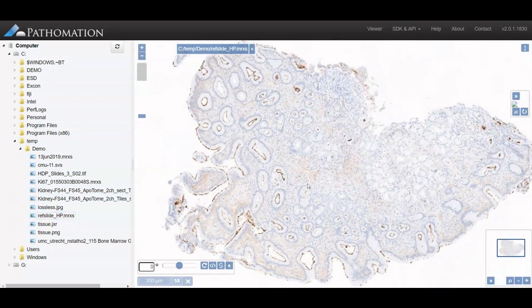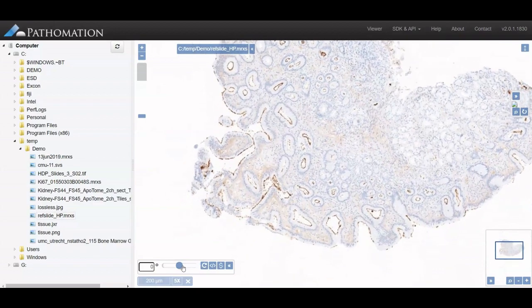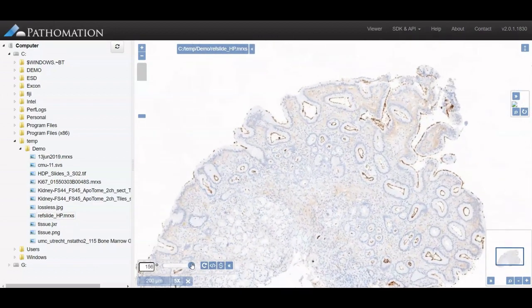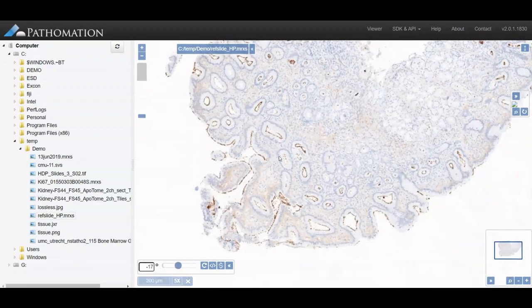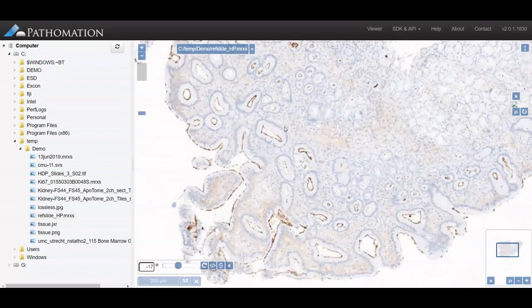You can move your image around, you can rotate, and you can easily zoom in and out and view all your slides.